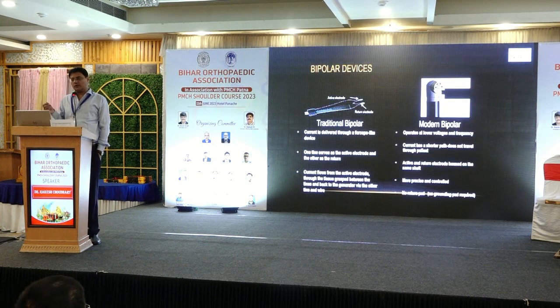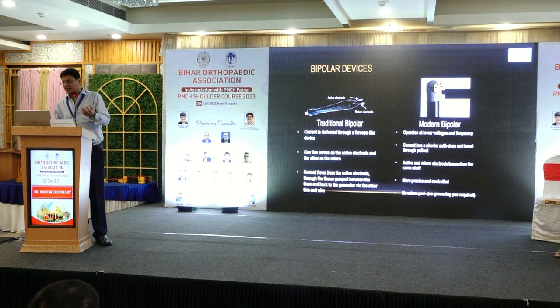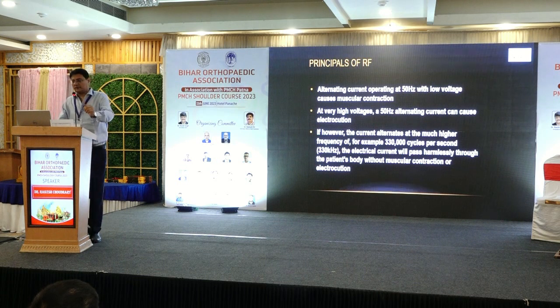Then bipolar, a forceps-like thing. From one pin, the current passes through to the other pin and back to the generator. There are also modern bipolars that work at a very low temperature, and both the terminals are there on the same end. Now, the principles of radio frequency.